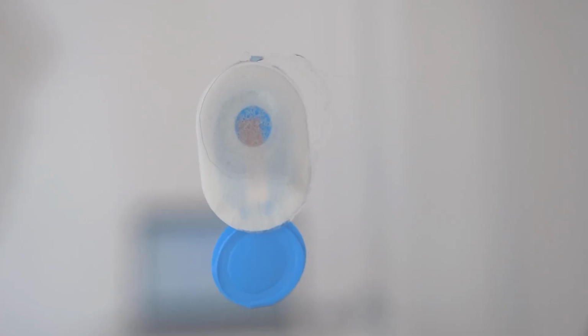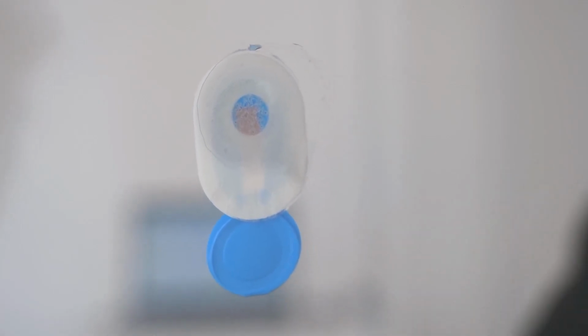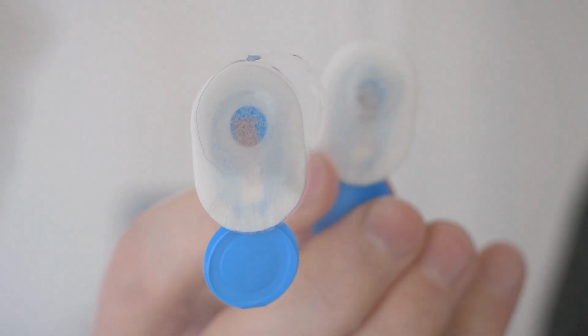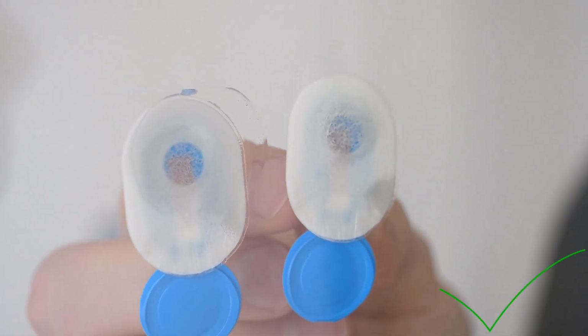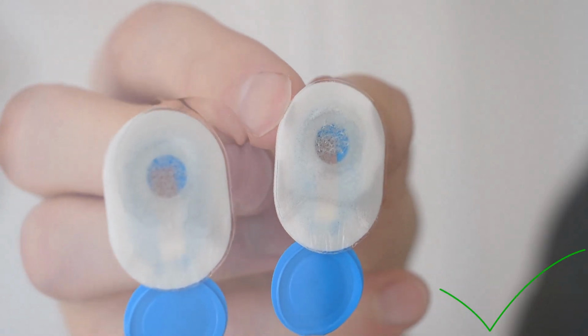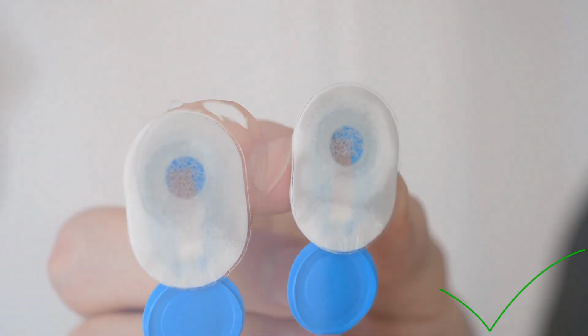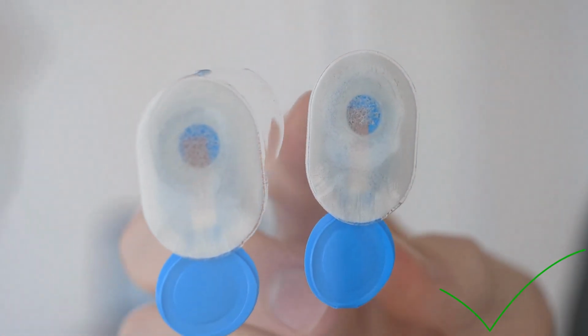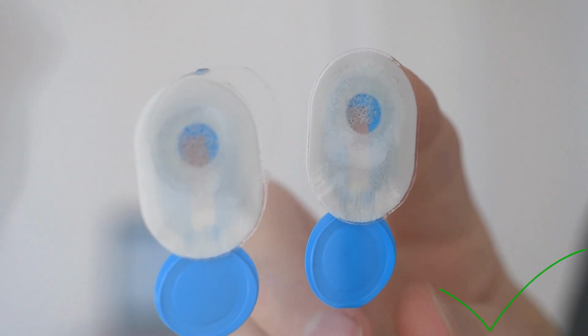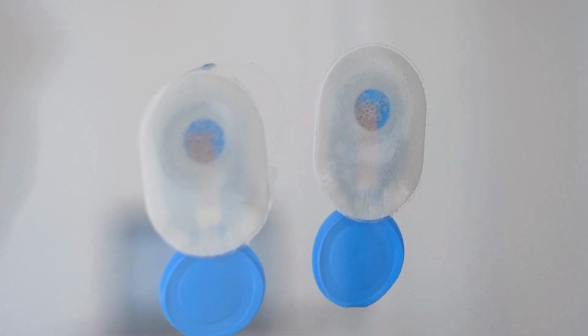The correct procedure is to position the electrode and apply pressure to the adhesive surfaces on the outside of the electrode. Then the contact gel stays centered where it should be. If the electrode is in place and a shift or strong noise can still be seen in the signal shortly after application, light pressure can be applied to the center of the electrode to establish better contact to the skin.